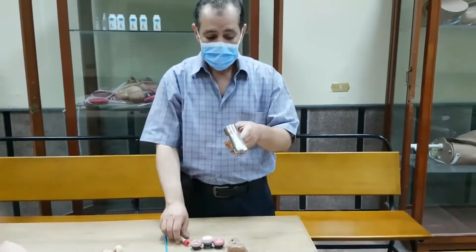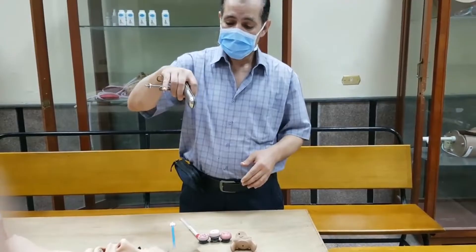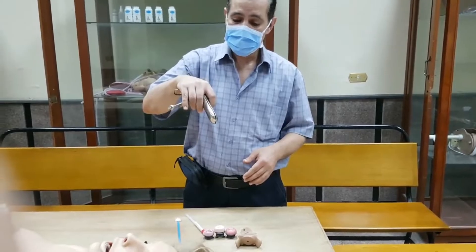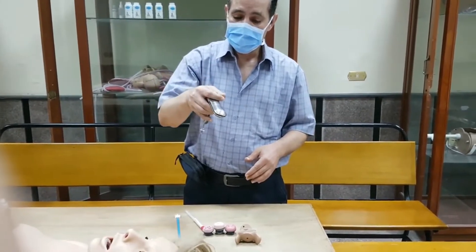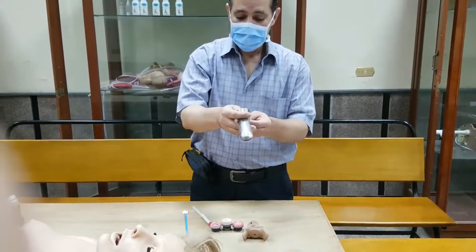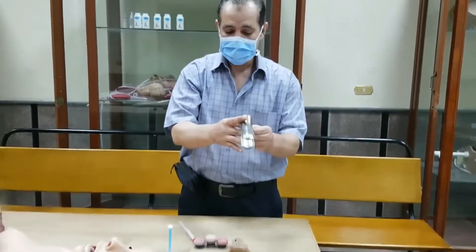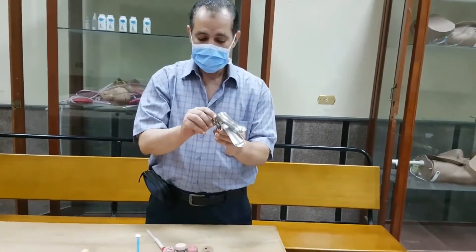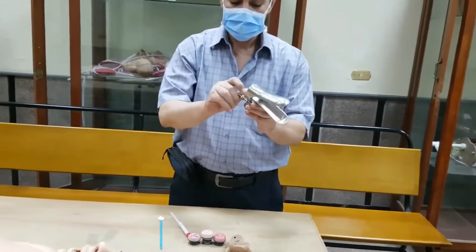Then, as you know, I insert the Cusco speculum in this direction and advance to half of the speculum, then I rotate 90 degrees, then I complete the insertion. After that, I open the blades of the speculum like that, till I can see the cervix in front of me.